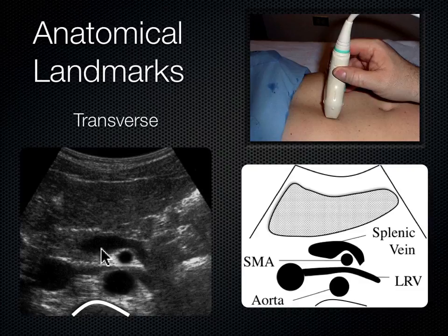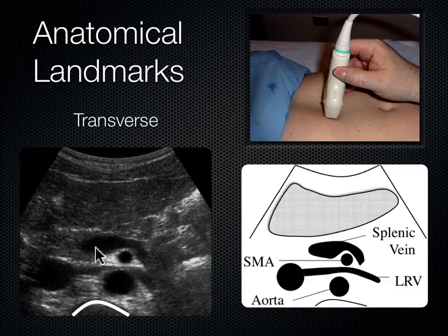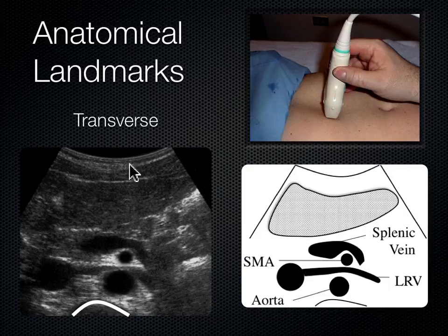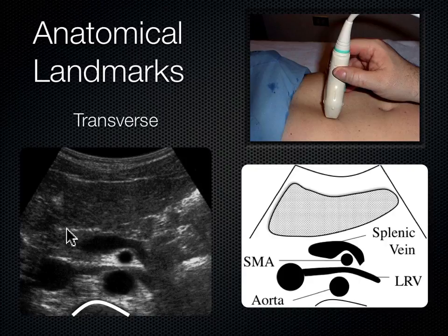The splenic vein is heading toward the portal vein when it meets the superior mesenteric vein. Outside the splenic vein is the pancreas, and above that is the liver. You can trace the margin of the liver as it comes around, and then there's the pancreas.